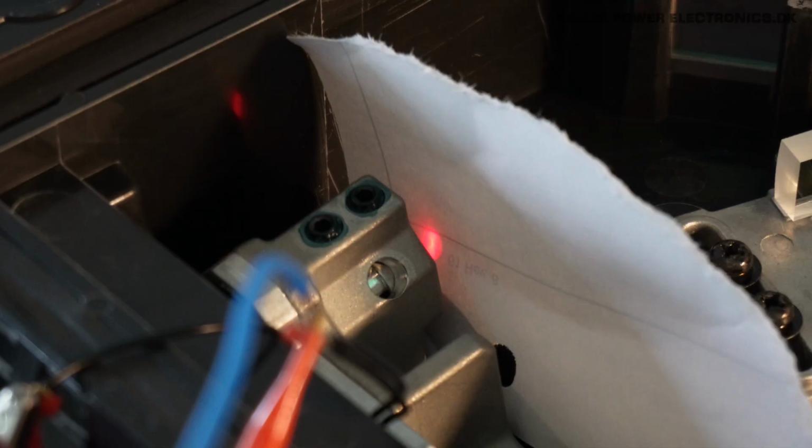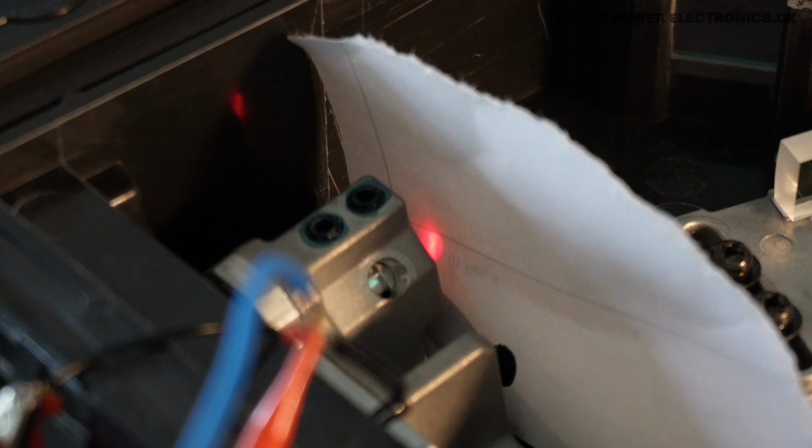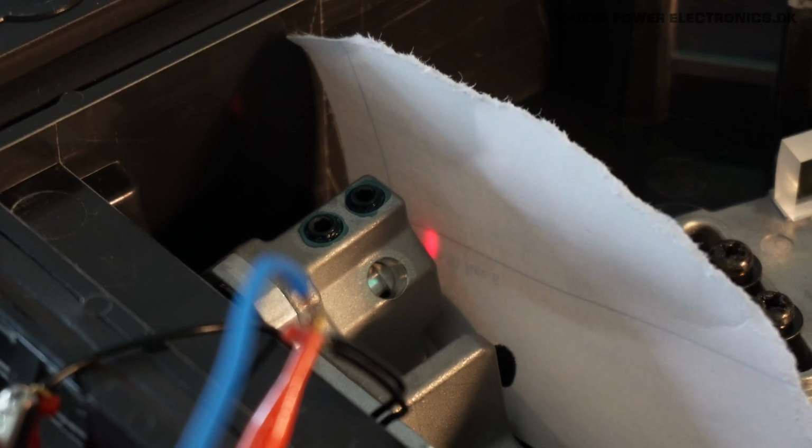About. Unfortunately, I'm not driving the laser beam hard enough, but as we can see here on a white piece of paper, that we do have a laser output. But I'm not going to push this any further. I think instead I will try to use a green laser pen and then point it in through where the laser diode here is mounted.